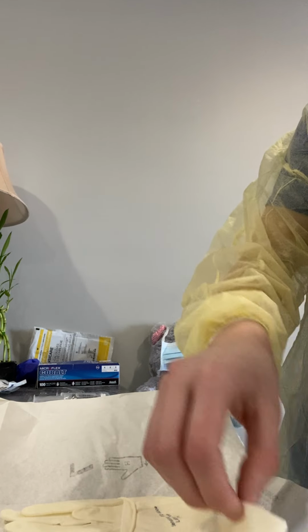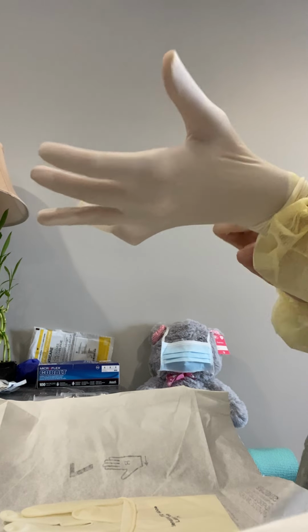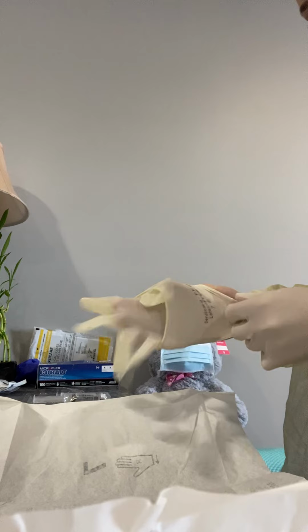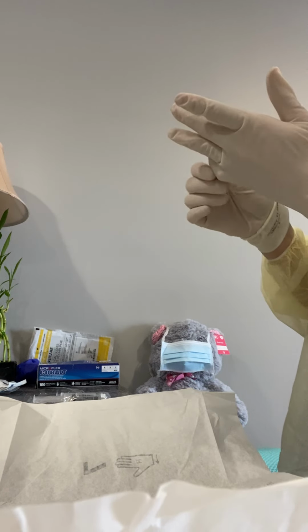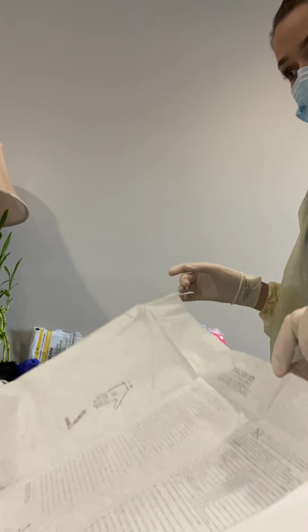Alright, get these gloves on. These are a lot better than the last ones, that's for sure. Okay, so I am now sterile. This is probably in your way, so I'm just going to go ahead and toss that.